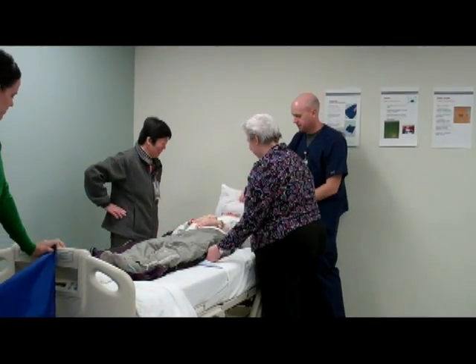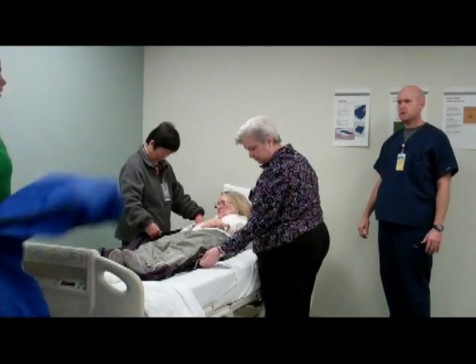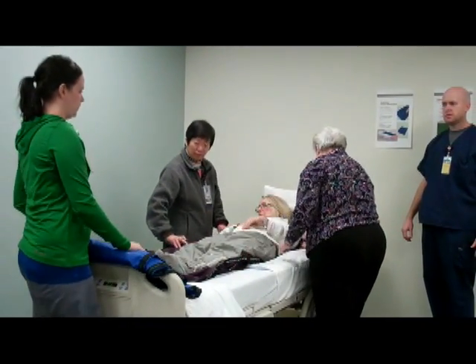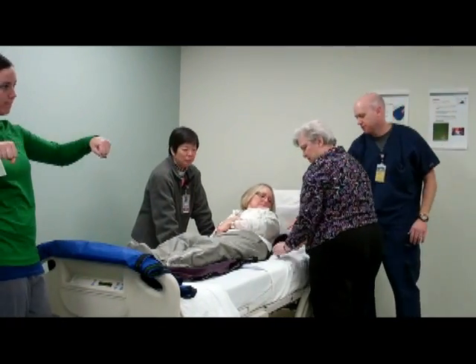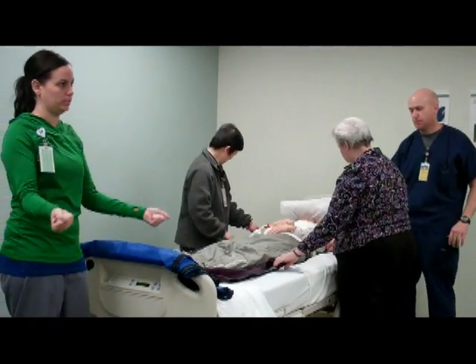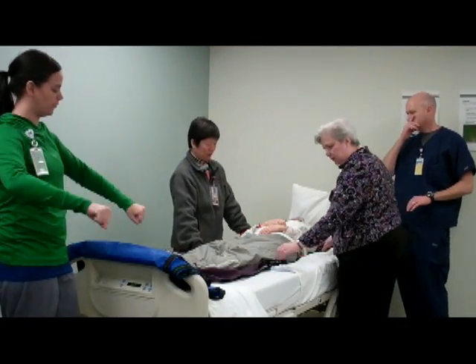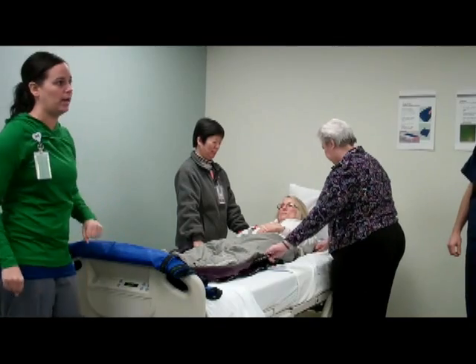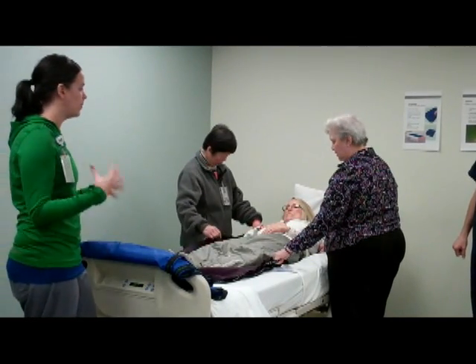Yeah, let's leave this up here. Okay. And they both have handles as well. One of the things to remember that we might not be doing right now on a regular basis is anytime you use anything with a handle, knuckles up. Because the second you go like this, you're going to be engaging your upper body and your core way more than you should. So if you keep your knuckles up and your hands pointed down, it's going to take a lot of the force off of your upper arms and your upper body when you move them.